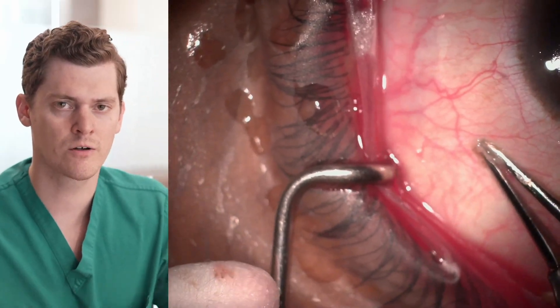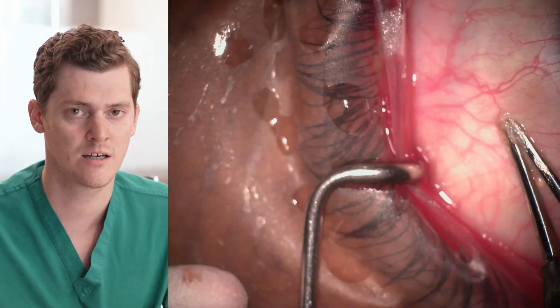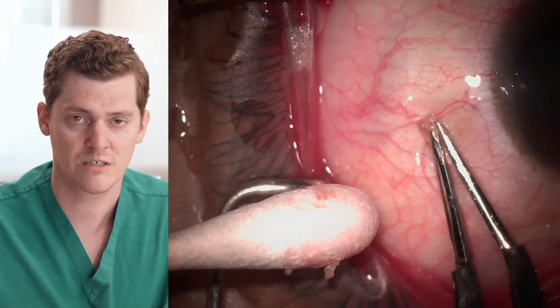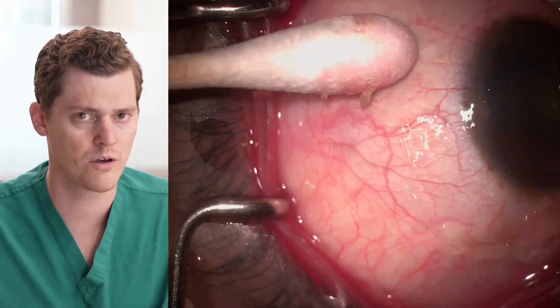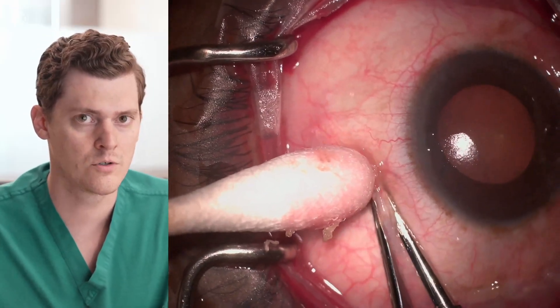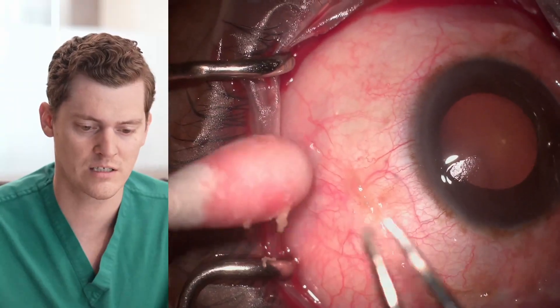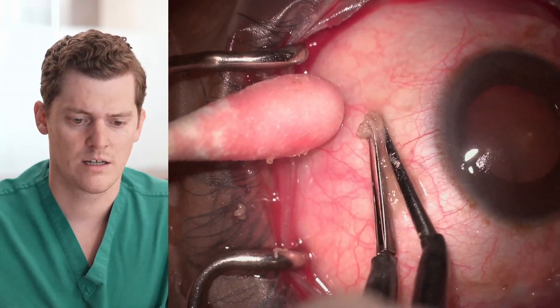While the inferior bulbar conjunctival chalasis may be the most clinically obvious on exam, the superior bulbar conjunctival chalasis may also be symptomatically bothersome because it interacts with the upper eyelid as the patient is blinking. Here you can see me shrinking some of the superior conjunctiva with the forceps, lightly, to the point where the conjunctiva has the appropriate tightness.